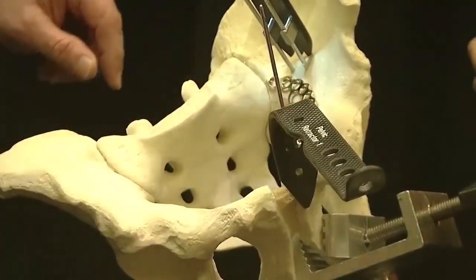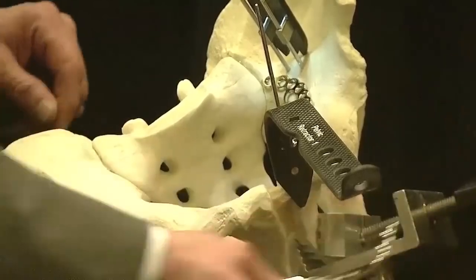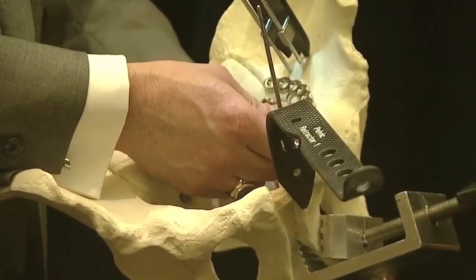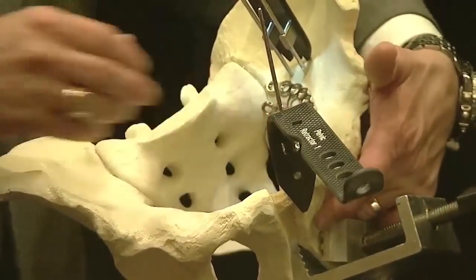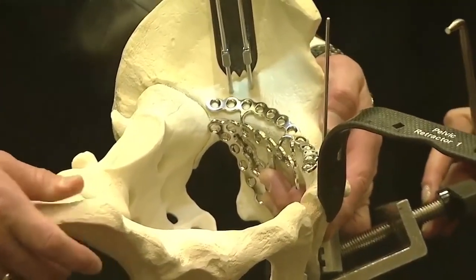It protects the soft tissues very nicely. This is the suprapectineal plate, and then we have the infrapectineal plate, which, for the sake of brevity, I'm not going to take the other one out, but it fits along the retro or infrapectineal surface and has a tab that folds over the top. So I think you guys can get the idea how that fits. Let me get my hand out of the way. There we go. That's a little better view.